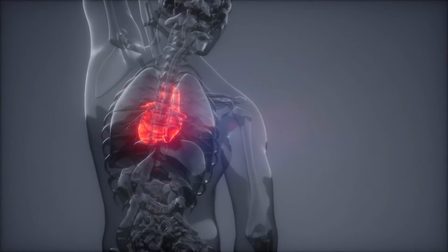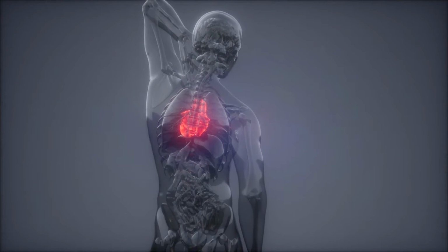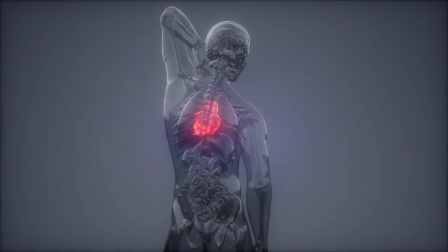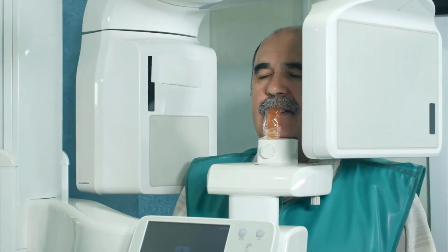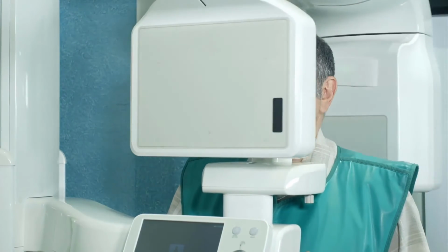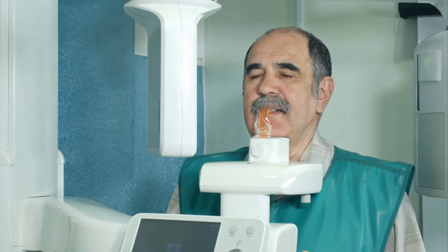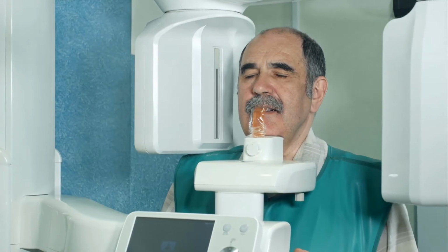The radioactive sugar moves throughout the blood system and travels to places that need it most. Tumor cells grow out of control, and so they require more glucose energy than most other cells. Areas of the body, such as the brain in suspected Alzheimer's disease cases, that do not exhibit a normal level of growth and glucose uptake show a reduced radioactive glucose uptake.